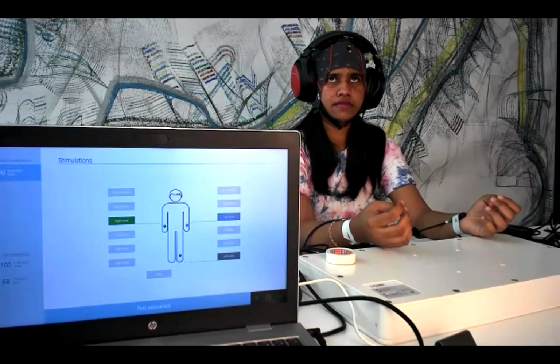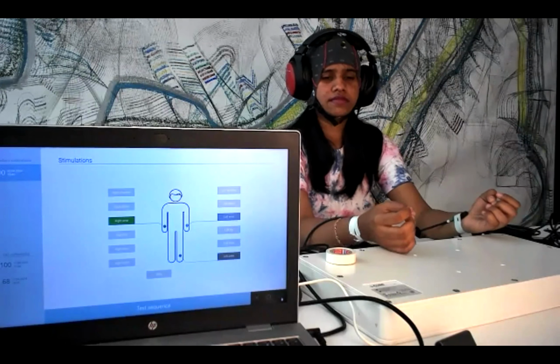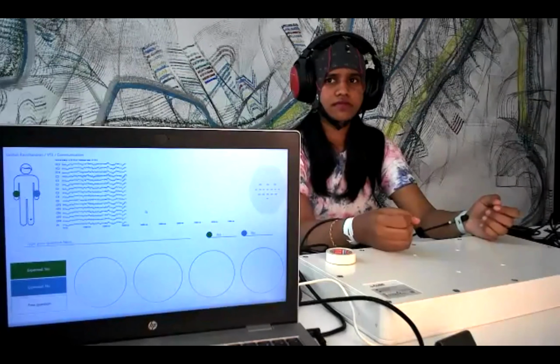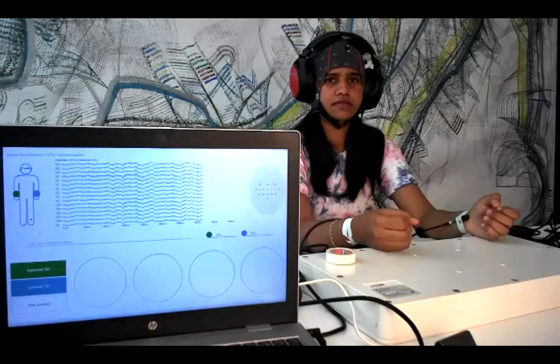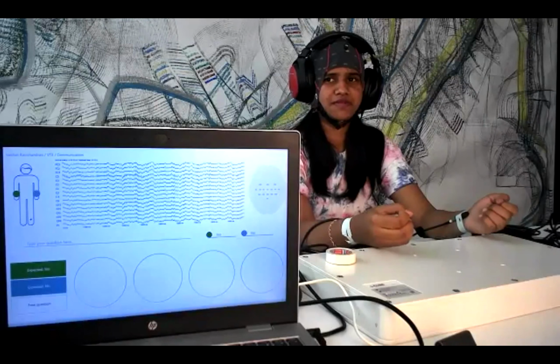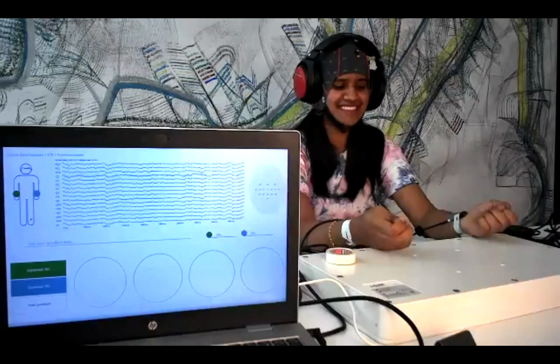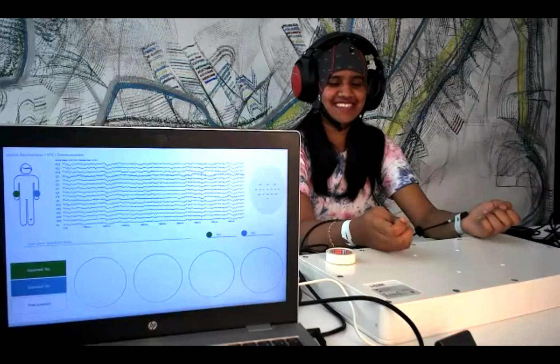We have a few from the previous one, but I think this one would be the best and the most recent one. So you can see here, it's a running page for the communication. So, I mean, we can type some questions here, and we could also ask questions. For example, Marshall, do you like the mindBEAGLE setup?